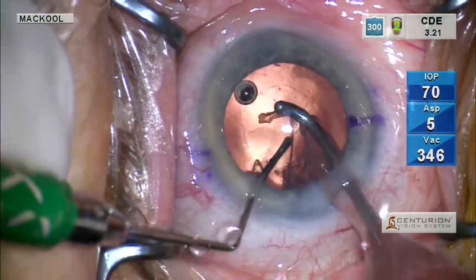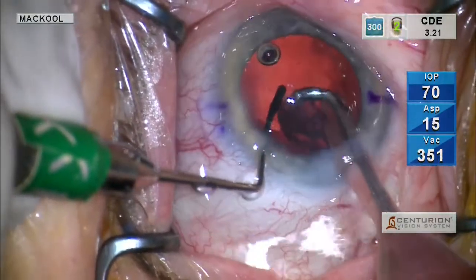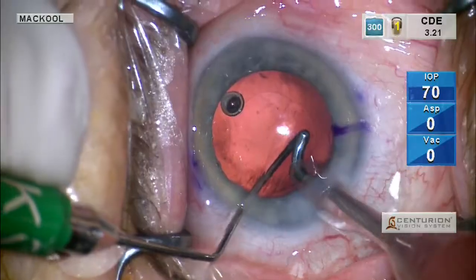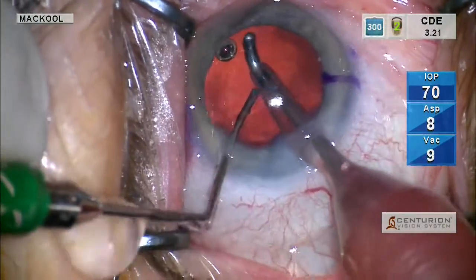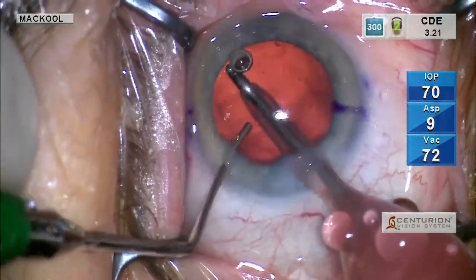Now in these eyes, at the end of this case, we're going to still have that viscoat right up against the endothelium. I won't be aspirating it. So they have to be watched carefully for a potential pressure spike. I'll just aspirate some epithelium here from under the anterior capsule.